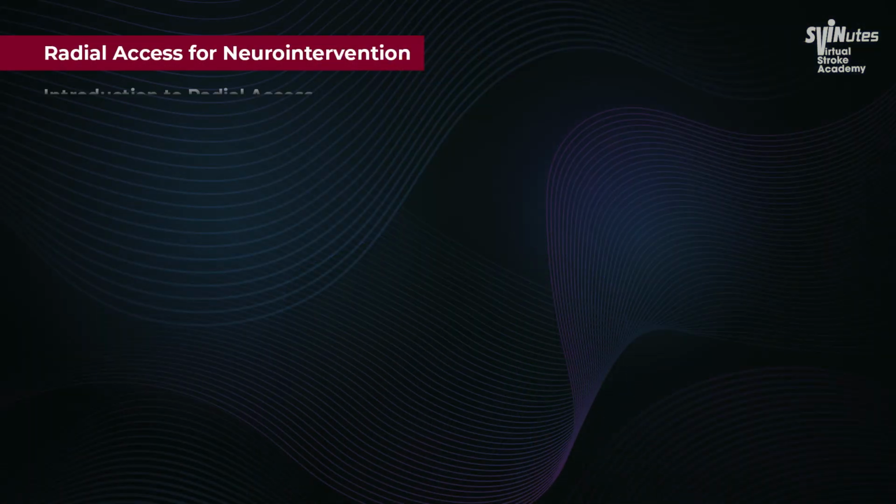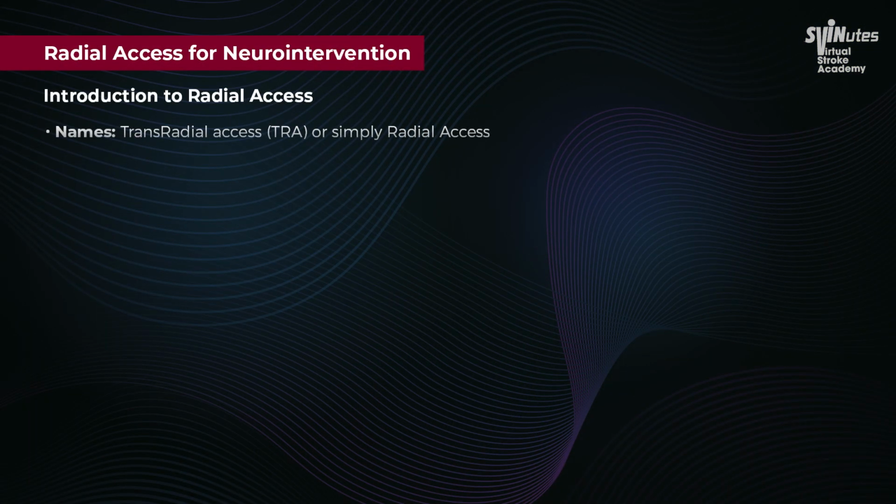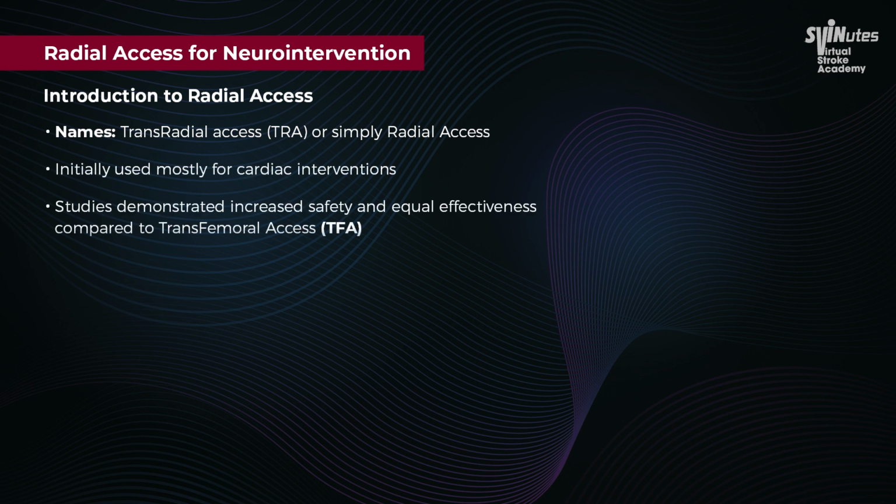Thank you for tuning in today to learn more about radial access for neurointerventional procedures. Transradial access, TRA, or simply radial access, was initially mostly used for cardiac interventions. Earlier studies demonstrated increased safety and equal effectiveness compared to transfemoral access, or TFA.